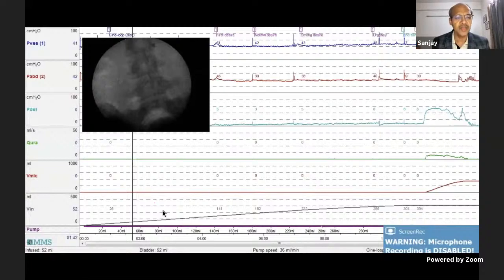Take a look at this woman who has persistent refractory voiding difficulty. You can see here, the storage phase looks fine. That's the voiding phase, micturition command. And there's a somewhat elevated pressure and a slow flow. The voiding pressure is about, these are 20-20 marks, so this is about 55 or so centimeters voiding pressure and a flow of about 7 or 8. So she is obstructed based on all criteria.